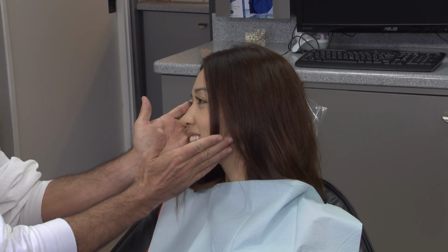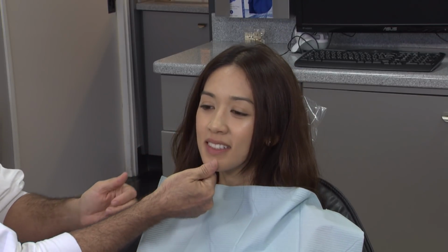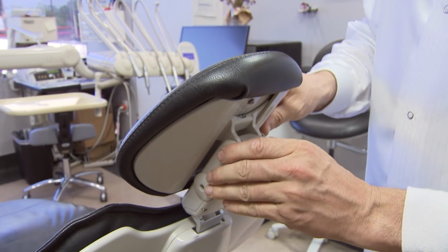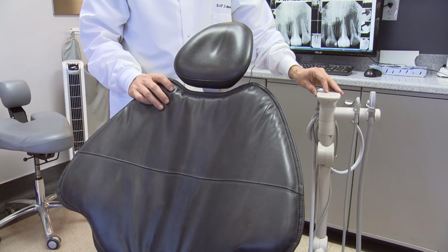Make micro adjustments to the patient's head positioning by tweaking the angles, tilting the chin up and down, and straightening the head to minimize the need to adjust photos later. If the head is still positioned on the headrest, slight adjustments to the chair allowing the patient to rest the head and make a steady base is advisable.